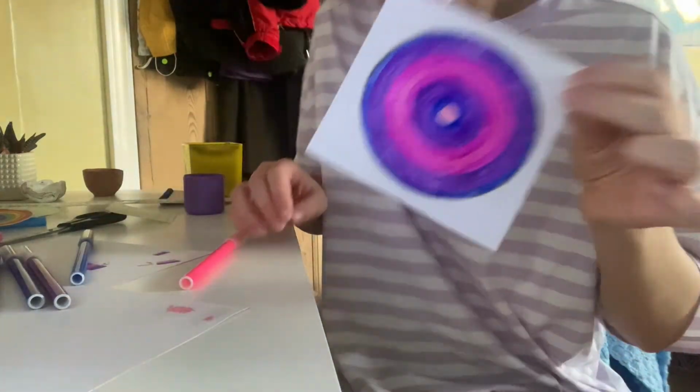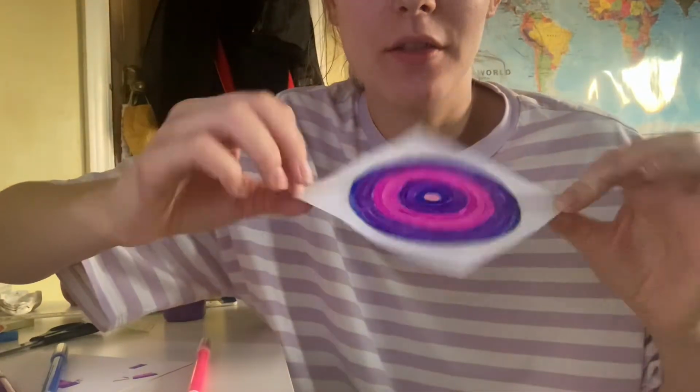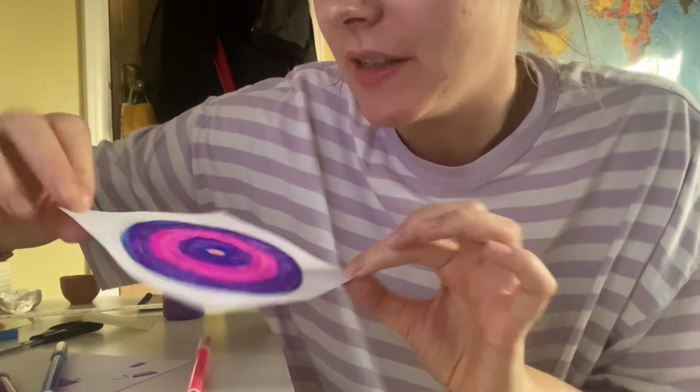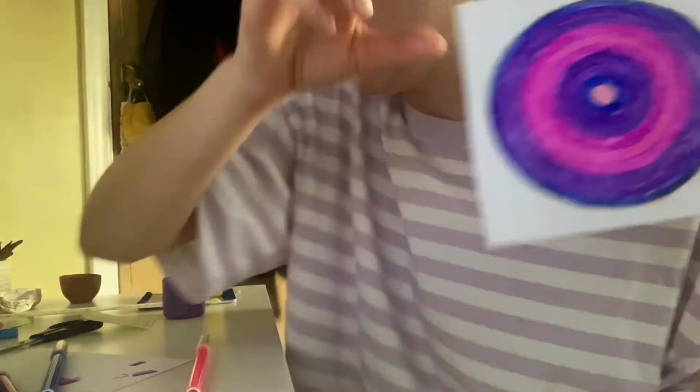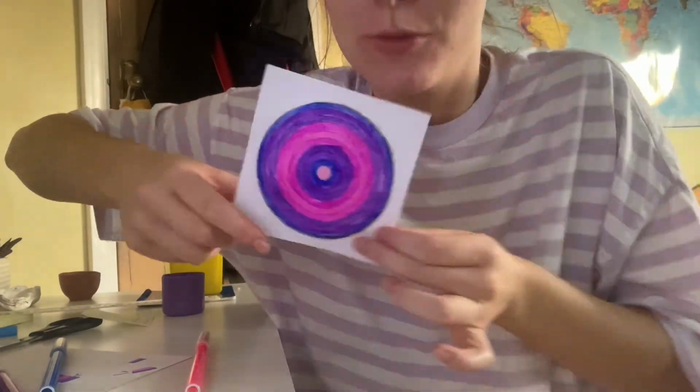Okay, so there it is. This is it, kind of finished. What I think I'm going to do is let this dry down, because as you can see it's a little bit patchy. My one is also a little bit patchy, but I think that's just where the glue sort of affects it. But I'm going to see if I can do another layer of it, and I'll come back and show you the finished product when it's all completely done, and we can have a chat about this thing.